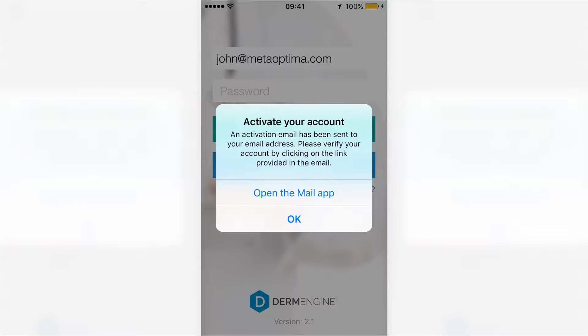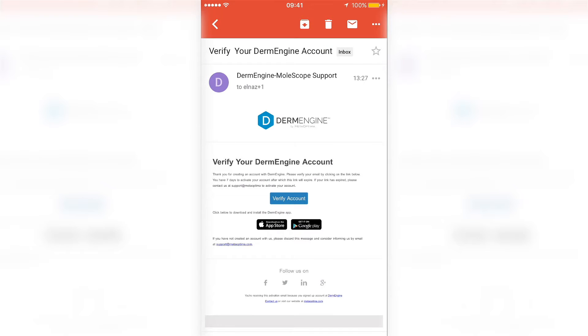An account verification email will be sent to the specified email address. You have 7 days to activate your account once receiving this email. Simply click on the Verify Account button to begin using DermEngine.